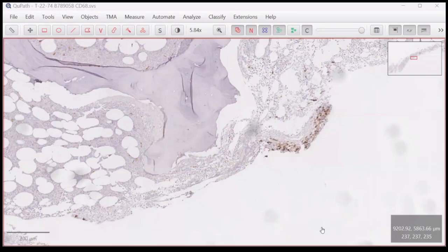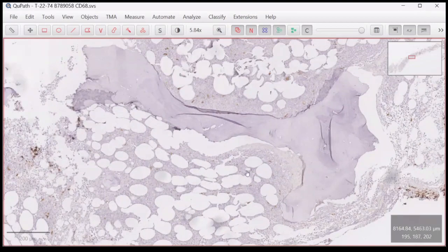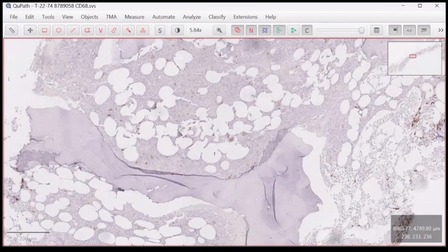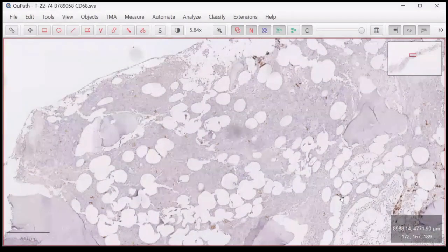Like in this case, the cells that express CD68 have clearer, darker nuclei as compared to the adjacent ones, which are more hazy. So we are wondering whether there are some problems, such as incomplete deparaffinization during the antigen retrieval, that make them not pick up the staining. They look quite hazy here. So first we have to confirm those erythroid.